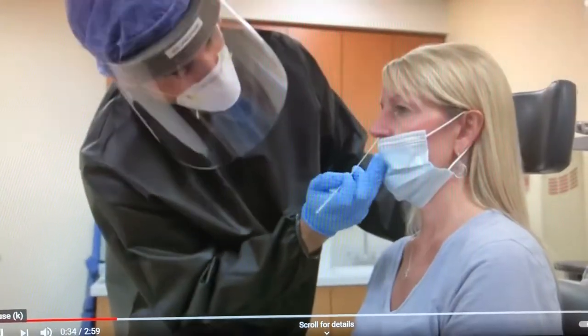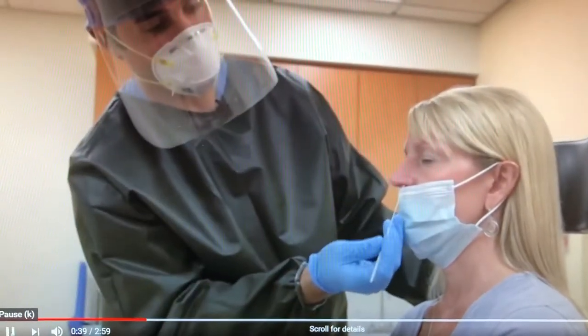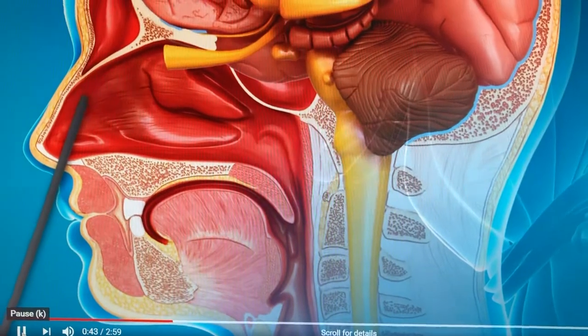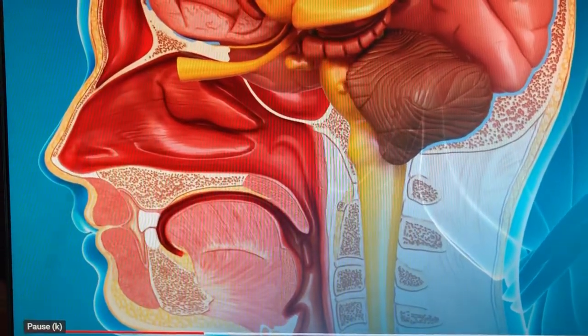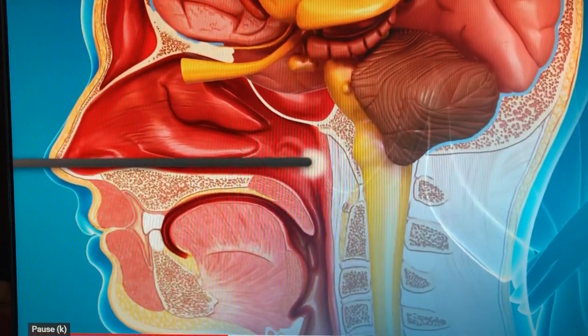The insertion in the nose is straight back, parallel to the nasal floor. There is a tendency to insert the swab straight up or at an angle, which aims towards the roof of the nose rather than the nasopharynx. The key is actually hitting the nasopharynx, which is straight back in the nose, parallel to the nasal floor.